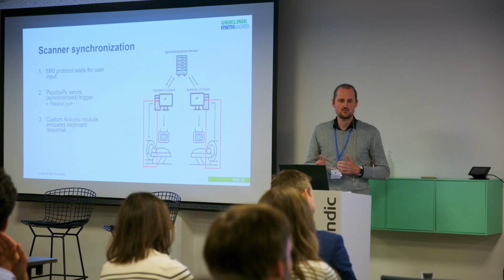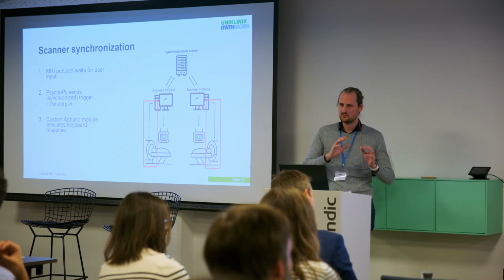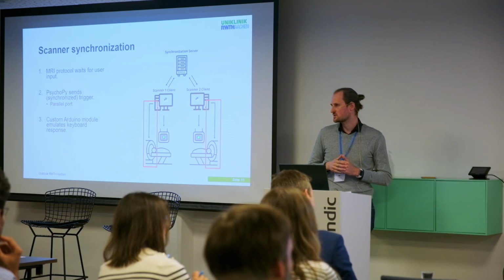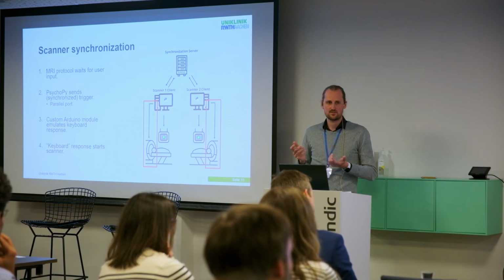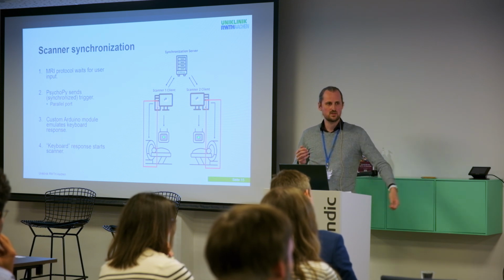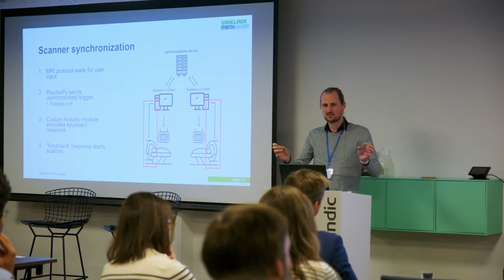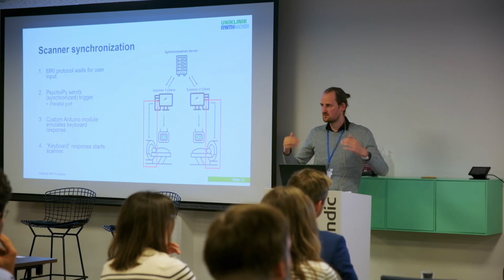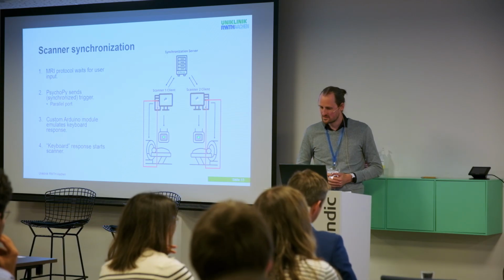This is then fed into a custom-built Arduino module, and this Arduino module would emulate a keyboard response, so it happens to emulate the enter or return button. This we plug in by USB to the scanner PC, and now we have a server which synchronizes the clients, which then send a message to the scanner, and we have two synchronized MRI scanners.